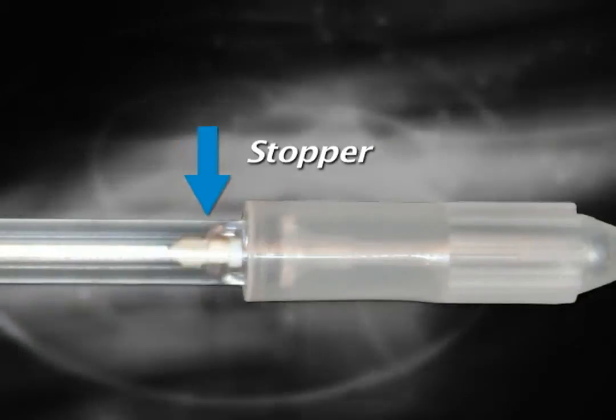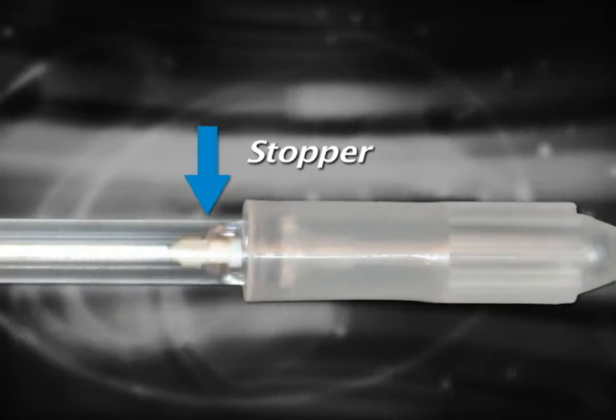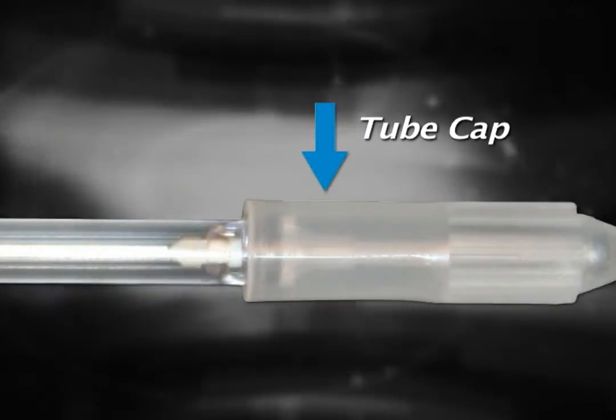The white stopper, located at the end of the tube, is partially seated to allow for collection, but will become fully seated once the tube cap, seen here, is applied to the front end of the tube.